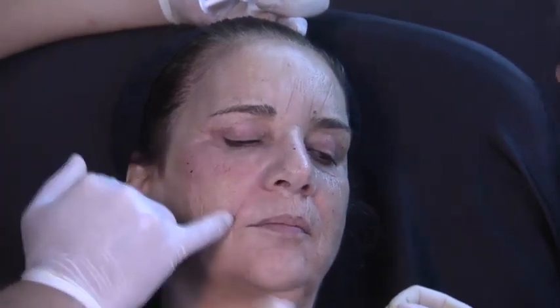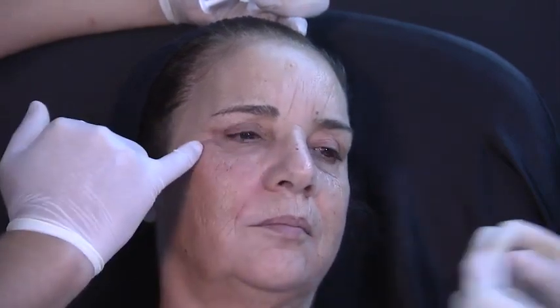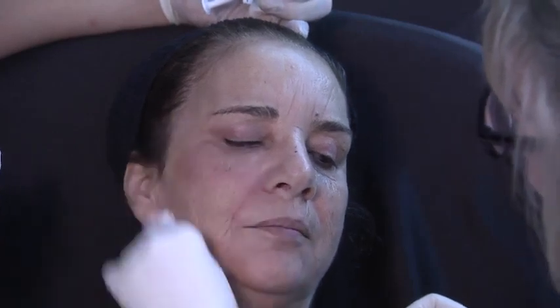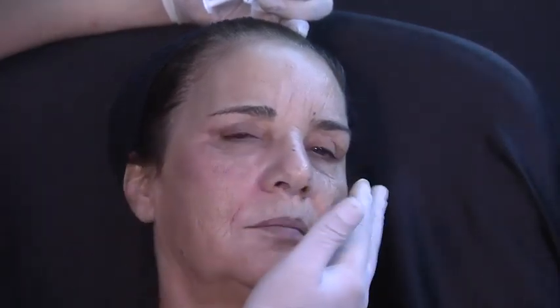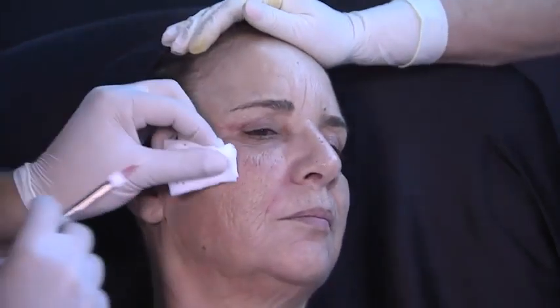I will create all this support, okay, and then I will do also the jawline, and I will create a second vector. So I agree that I can do this. But with this limited budget today, she's now had 1 ml of Lift, 0.5 of Define, 0.5 of Restylane, and 0.5 of Vital Light. So this is 2.5 milliliters for half the face. This is going to be a 5 ml treatment.